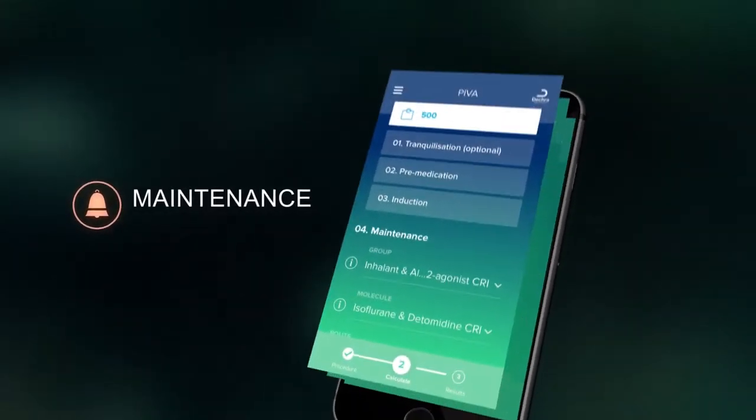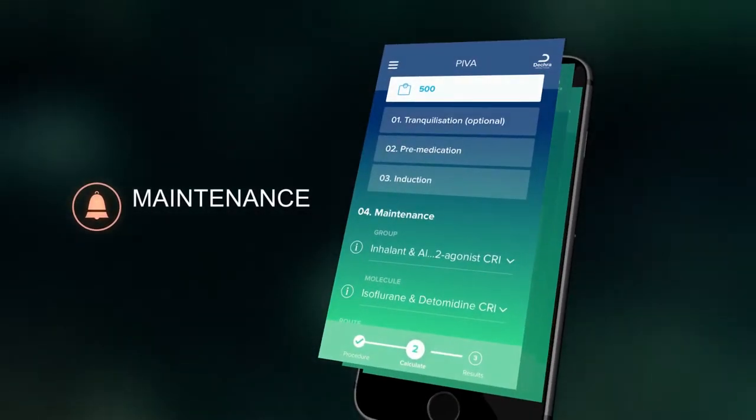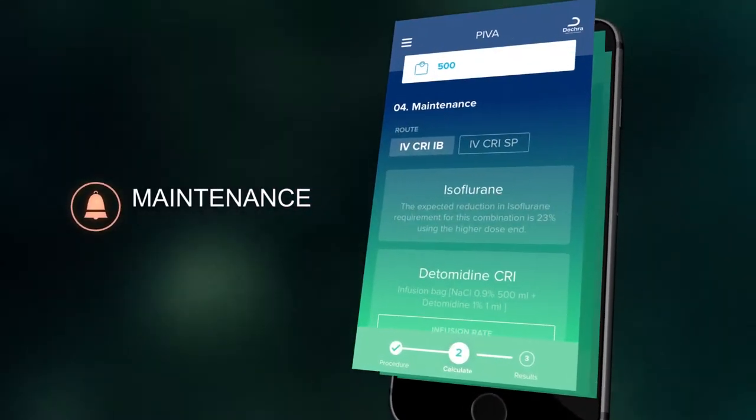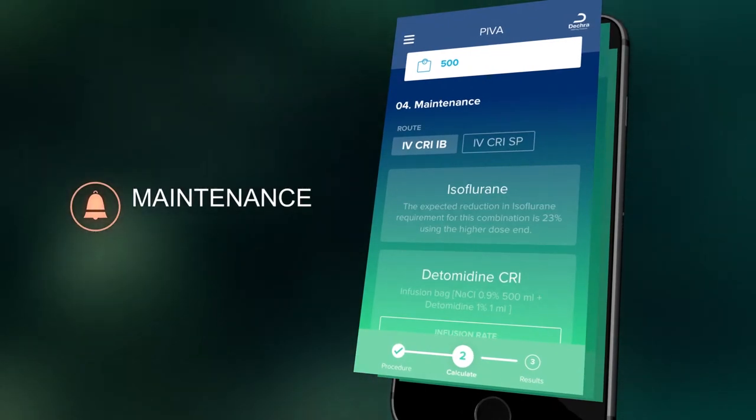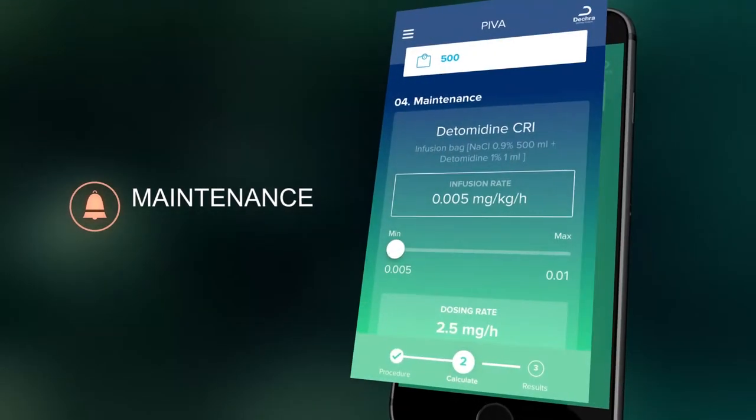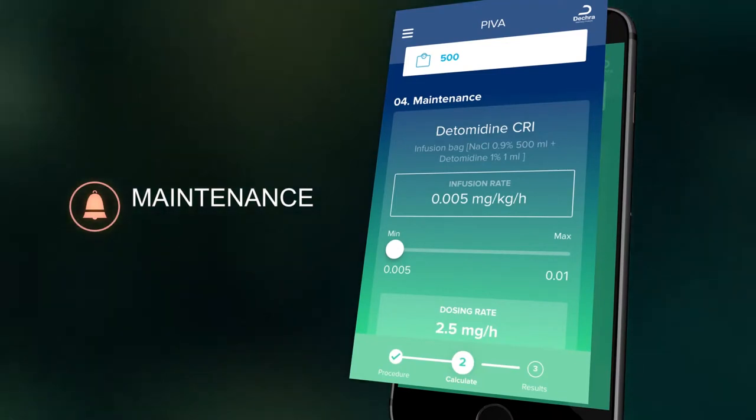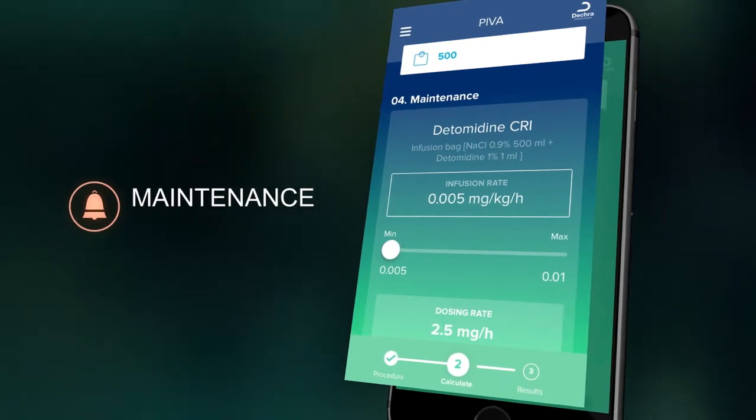For maintenance, you can select which combination of molecules you would like to use and whether you would like to administer them with a syringe pump or via infusion bag. The composition of the infusion bag is displayed and it is possible to adjust the drops per ml depending on which type of infusion set you are using.